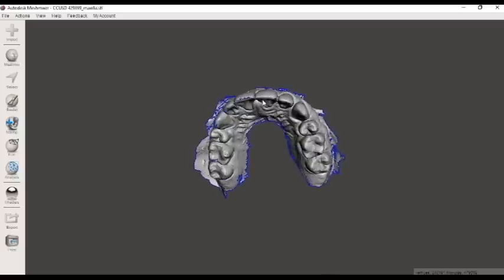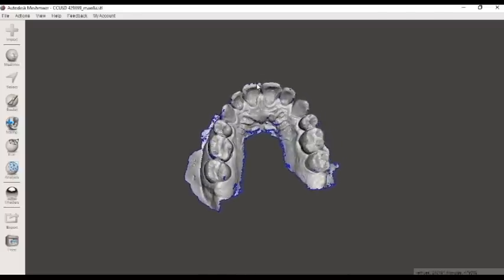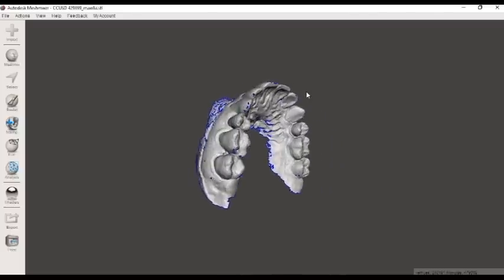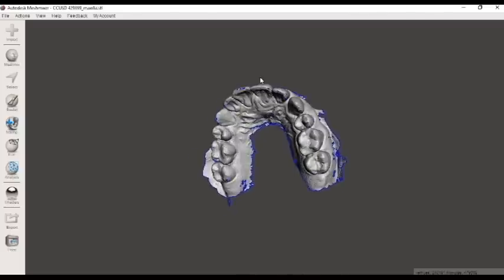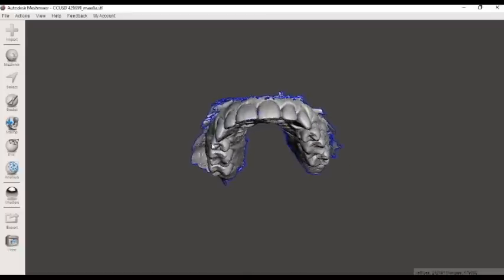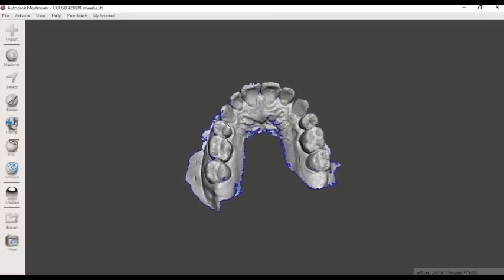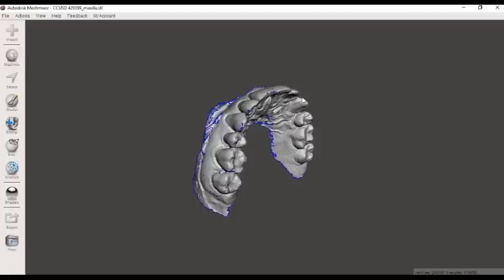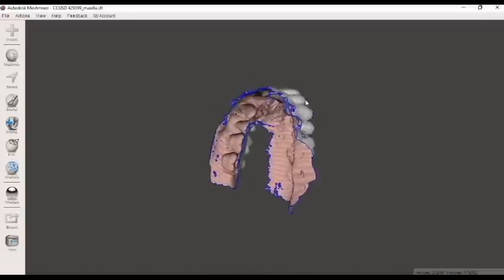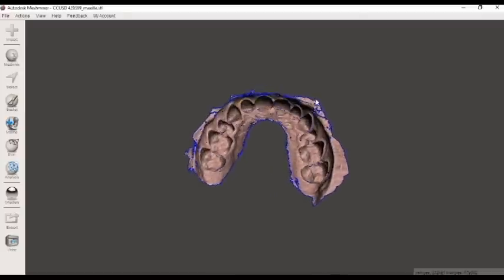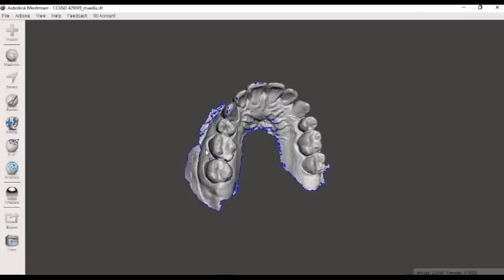So we begin by just seeing what we need to do here. We need to fill the holes. We need to trim some of the gingiva here, the cheeks that got in our scan. We need to put a base on it and make it a solid model here with a nice base.